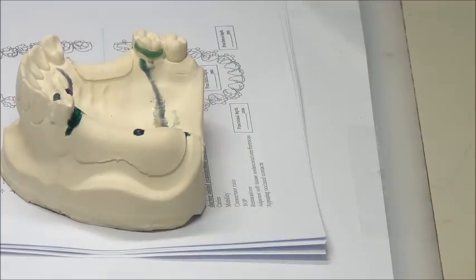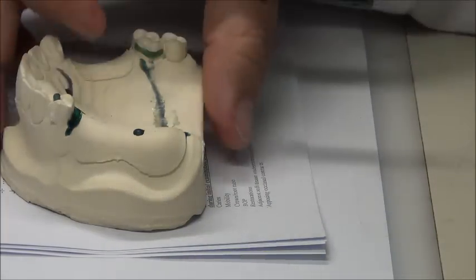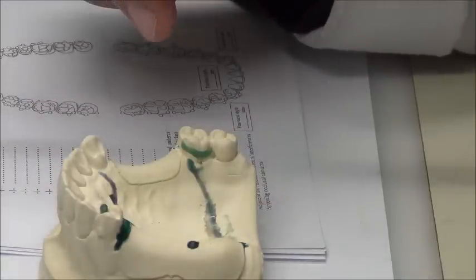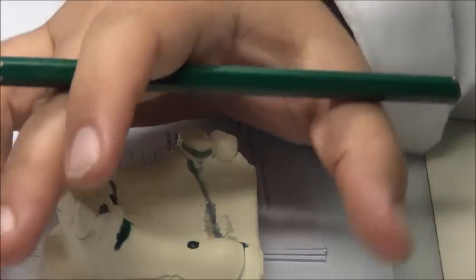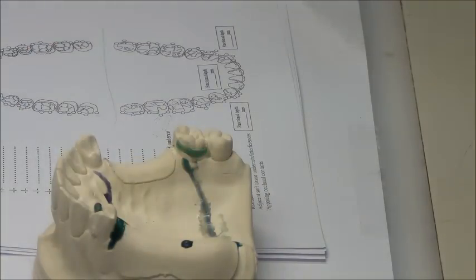A patient came to me and I took an impression. This is the cast. Okay, what do I do to this cast? Survey. Okay, so one of the steps is surveying. Surveying is an initial step. What else should I do before I begin my design?